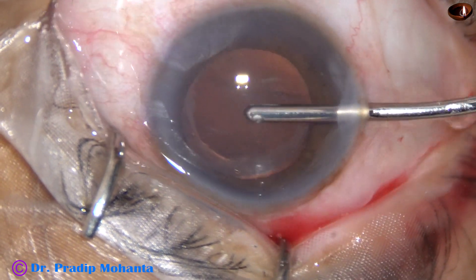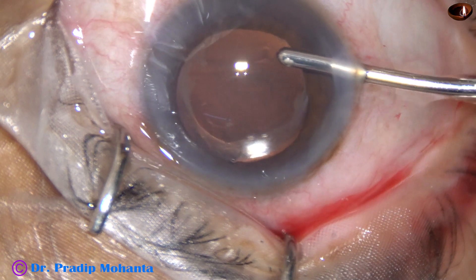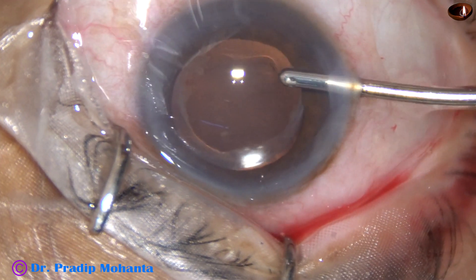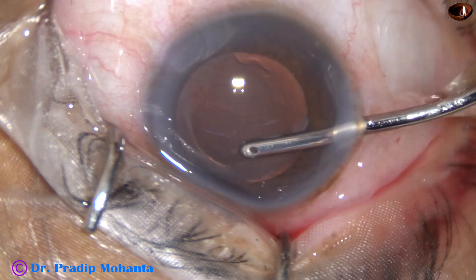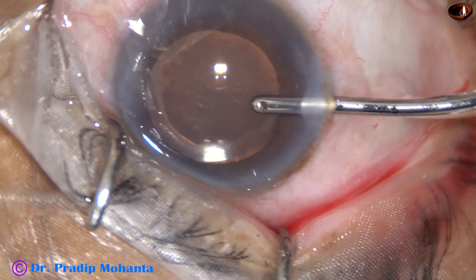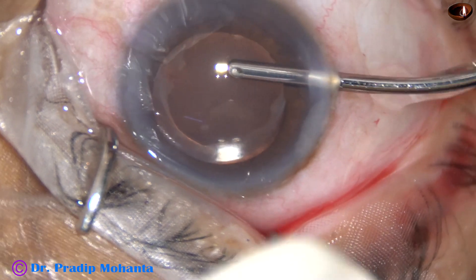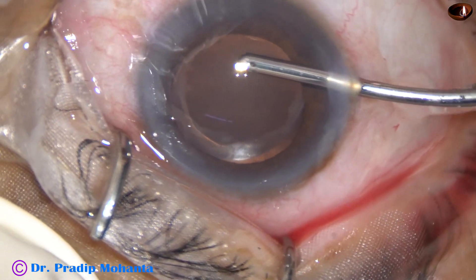I perform a thorough anterior chamber lavage and try to go behind the anterior capsular rim.